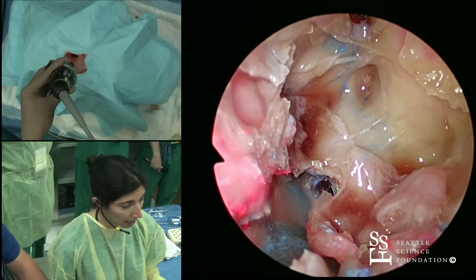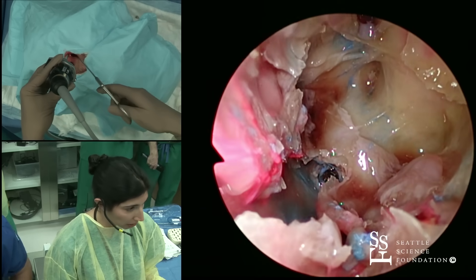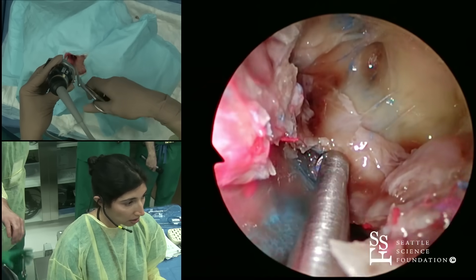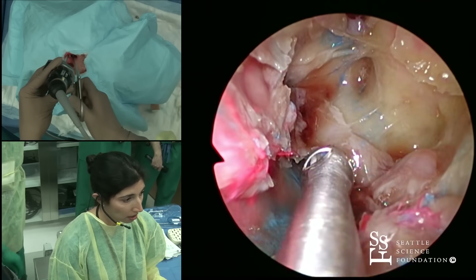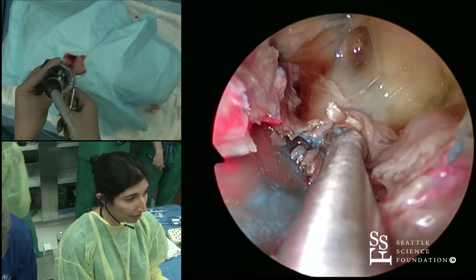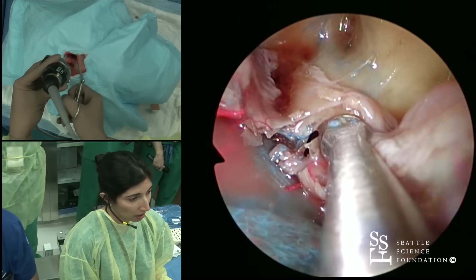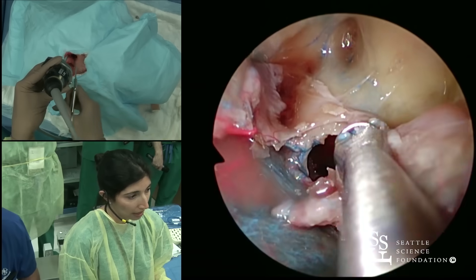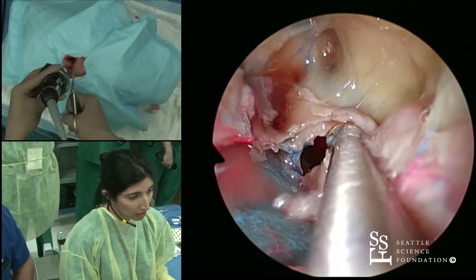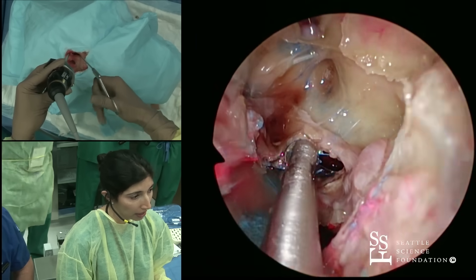Now I'm going to take that straight mushroom punch. Like I said in my talk, usually I use a straight Hoseman punch, but we have a straight mushroom today, so that's what we're going to use. I'm just going to start opening here laterally. I do this in a pretty systematic way where I try and kind of open up to the side, and then as soon as I can see better, I start opening up more superiorly here.